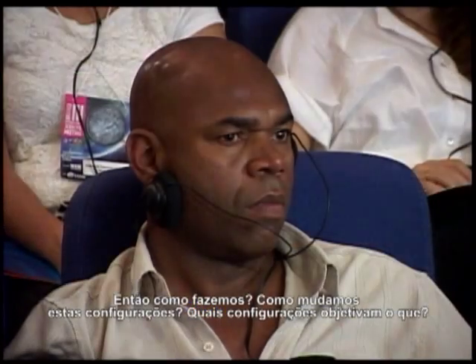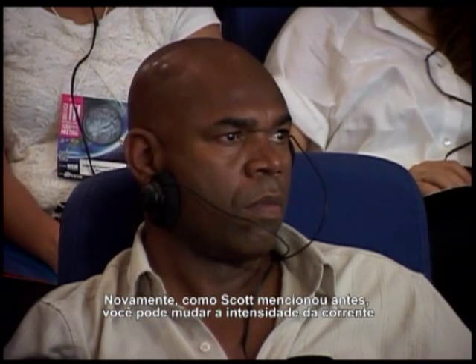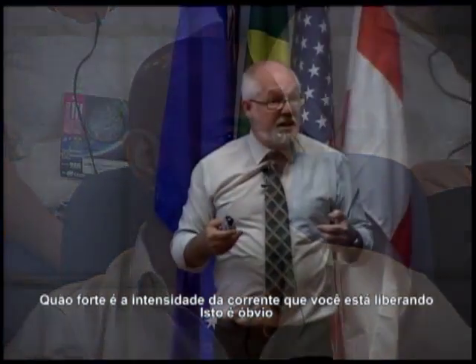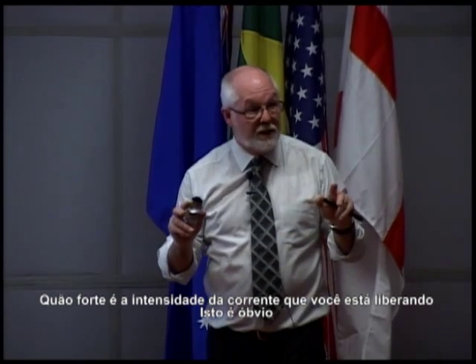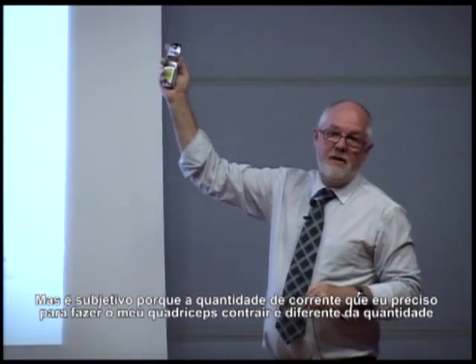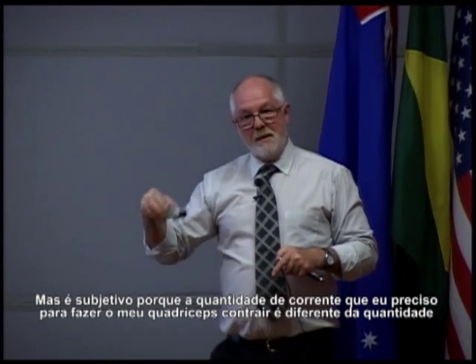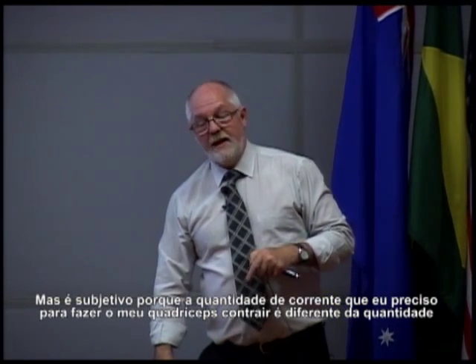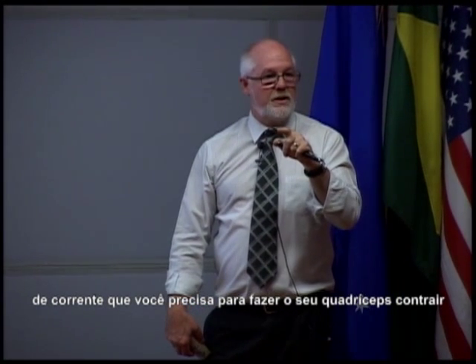Which settings achieve what? Again, Scott mentioned earlier, you can change the current intensity. Your current intensity, how strong is the current you're delivering? It's obvious, all right? But it's subjective, because the amount of current I need to make my quadriceps contract is different to the amount of current you need for your quadriceps to contract.